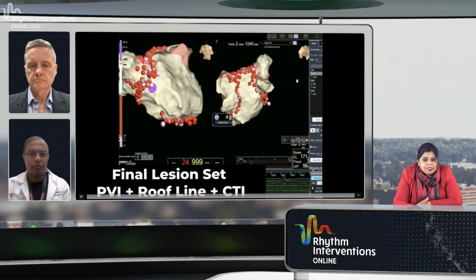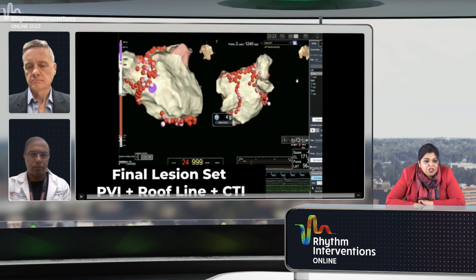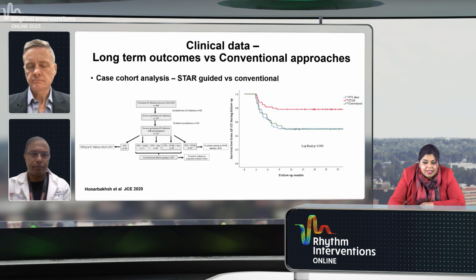I'm starting to realize that I probably need to have more input than just anatomical ablation, especially in some of these redo cases.